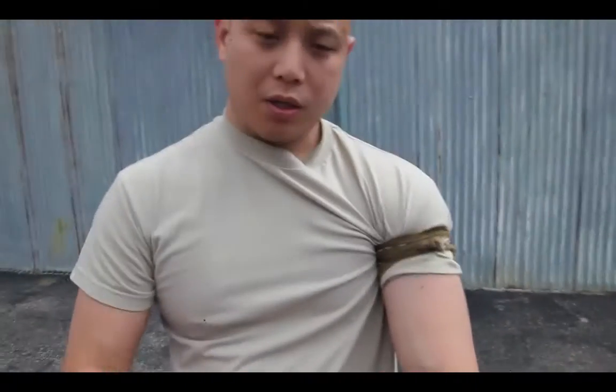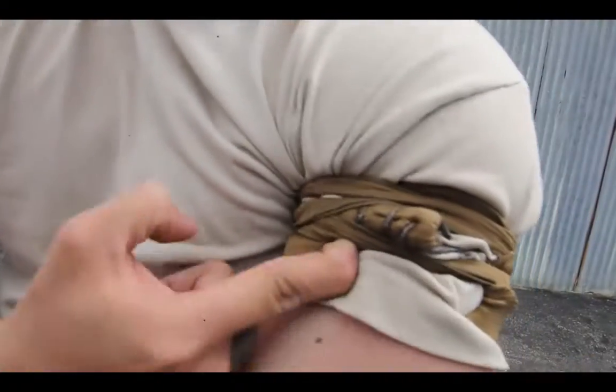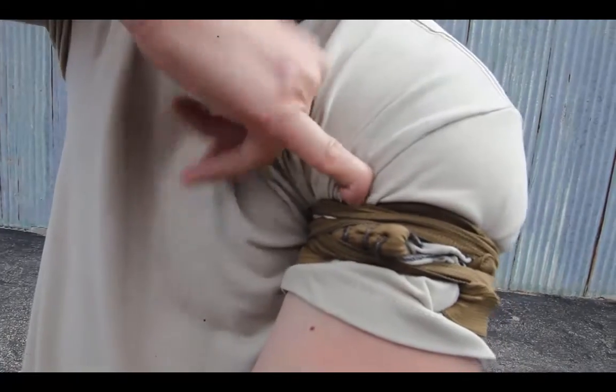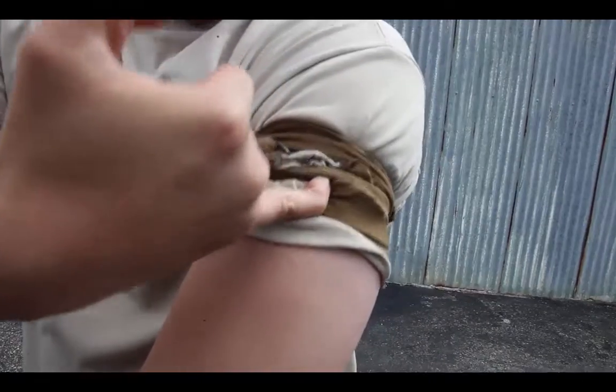You'll start to feel numbness and a little tingly at first. Applying a tourniquet is painful — some people describe it as just as painful as the original wound. But it is life-saving. High and tight on the limb, put it on, wrap it down, cinch it down tight. Other ways to check: the one-finger rule — if you can slip a finger underneath that tourniquet, it's too loose. As you can see, I can't even squeeze in my little finger, so that's on there pretty tight.